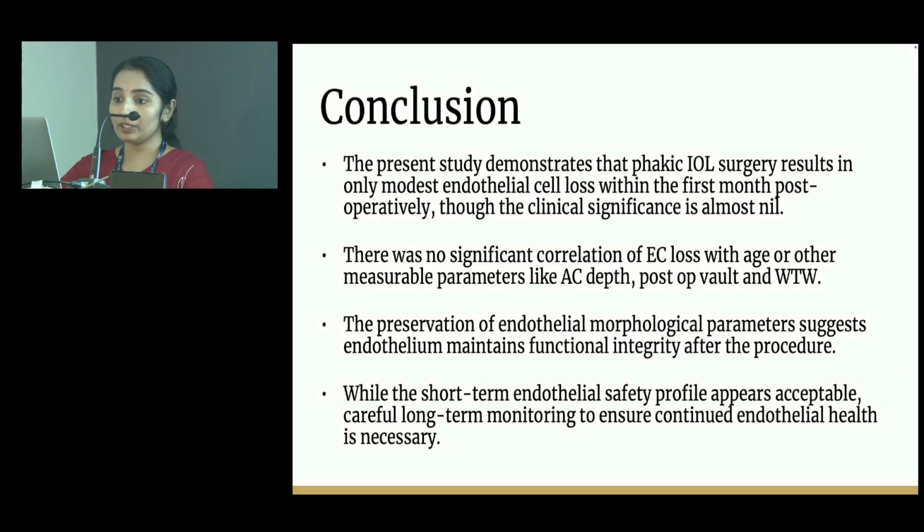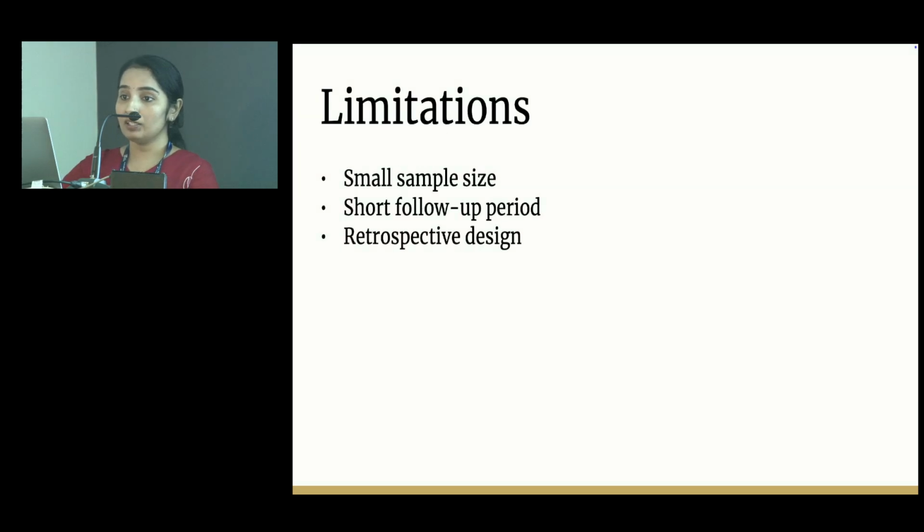While the short-term endothelial safety profile appears acceptable, careful long-term monitoring to ensure continued endothelial cell health is necessary. The limitations of the study were small sample size, short follow-up period, and the retrospective design of the study, which necessitate larger prospective investigations with extended observation periods to definitely establish the safety profile of phakic-IOL surgery.